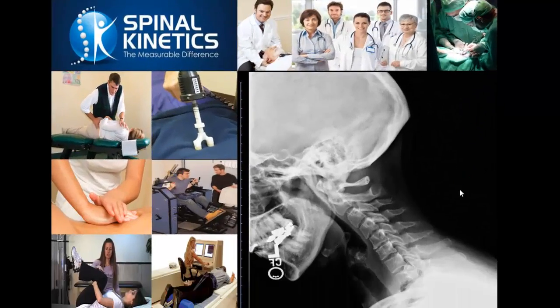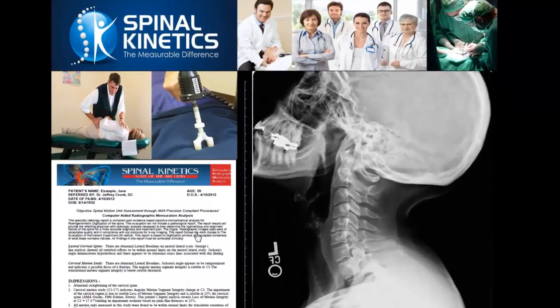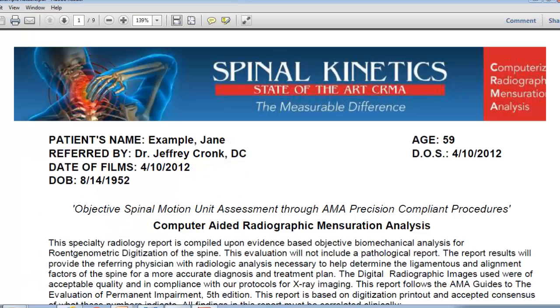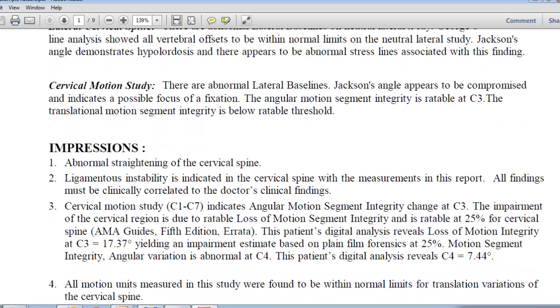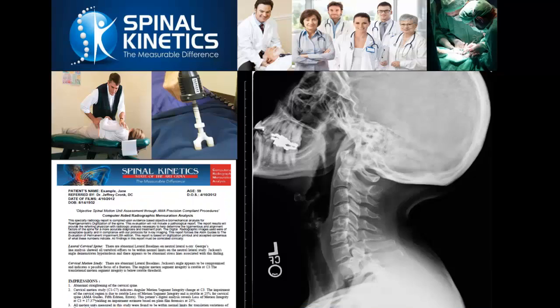In the last scenario, looking at the cervical motion study, we immediately see a rateable angular segment at C3 — meaning we have a severe or significant sprain finding with significant joint laxity — Grade 2 to Grade 3 sprain findings at C3. The readout of the angular finding qualifies it, and we can definitely become a lot more objective in our sprain or soft tissue injury analysis.